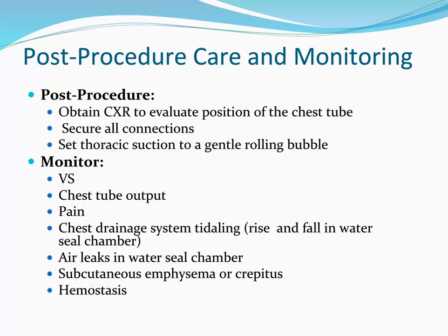Monitor for tidaling in a water seal chamber. This indicates that negative pressure has been restored in the chest, and fluctuations in thoracic pressures are evident. Monitor for air leaks in a water seal chamber. It is normal to have an air leak on insertion, especially when relieving a pneumothorax. Once the air has escaped and the seal is obtained, the air leak will often stop.